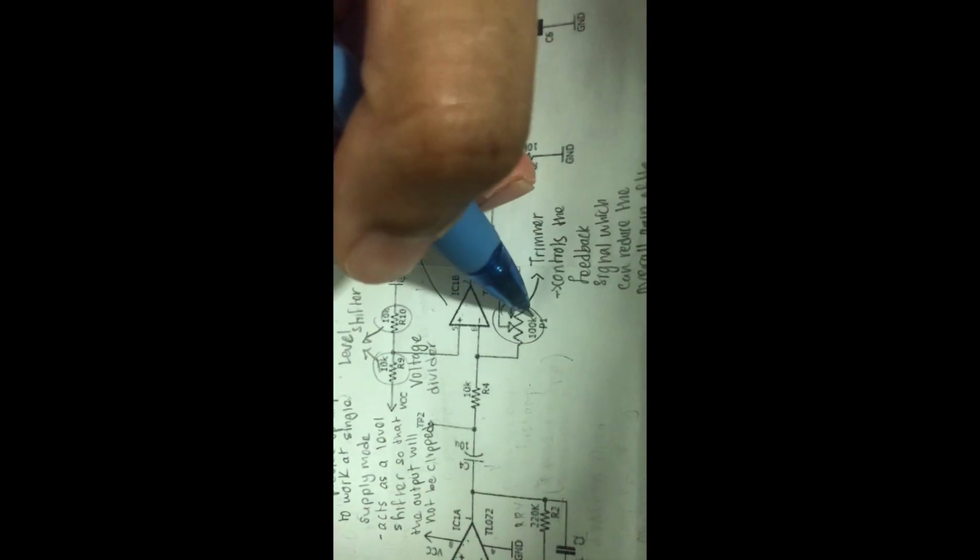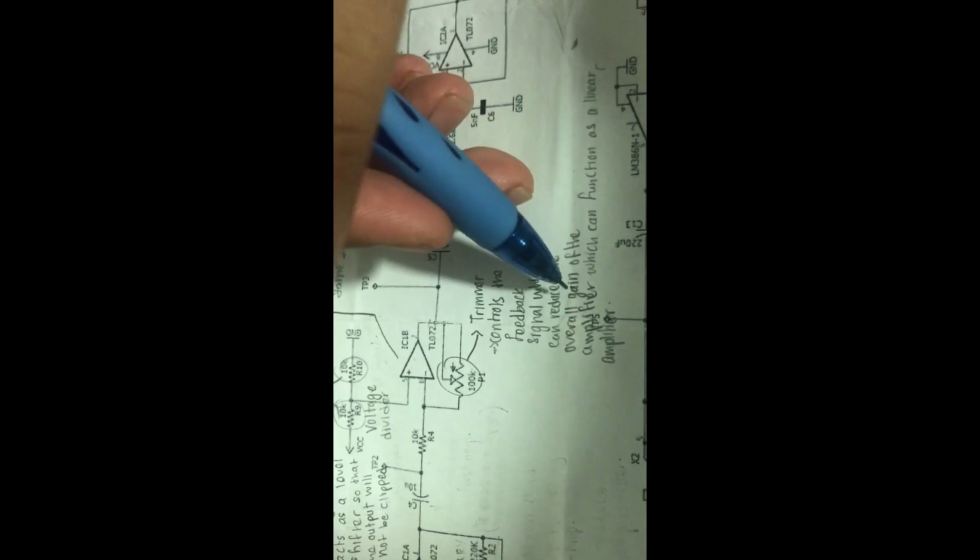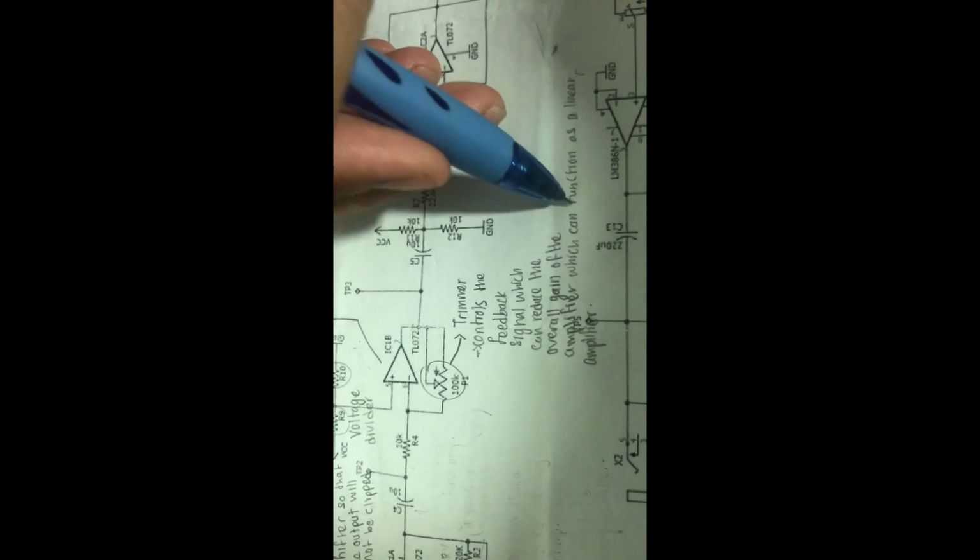Let's see it as a whole. As you can see, we have a trimmer here. It's a 100k trimmer. What does the trimmer do in this particular circuit? It controls the feedback signal, which can reduce the overall gain of the amplifier, so it can function as a linear amplifier.